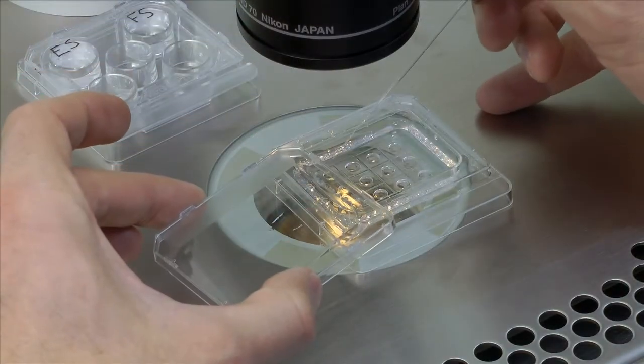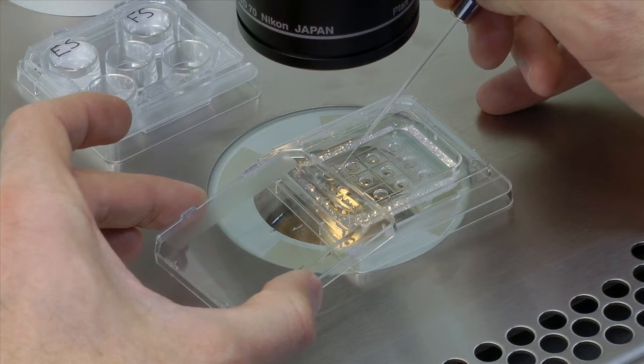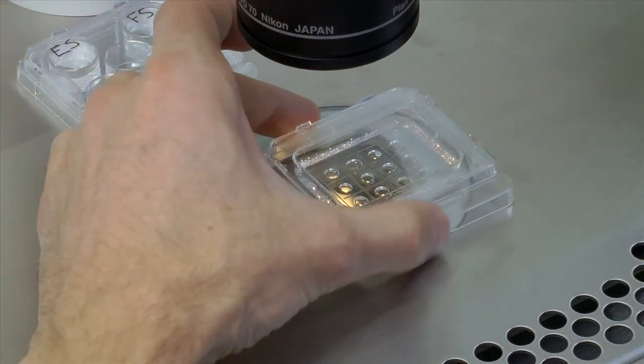Place the embryos in the equilibration solution and rinse properly. The embryos can stay in the equilibration solution for 10 minutes.